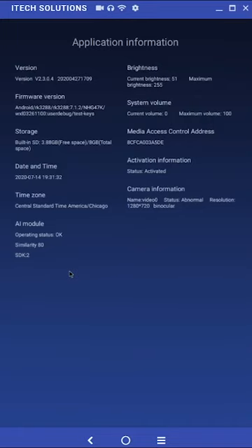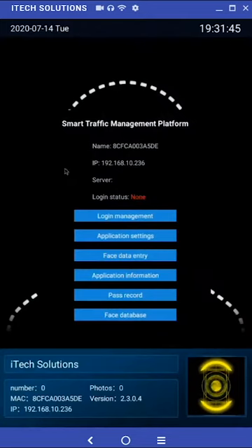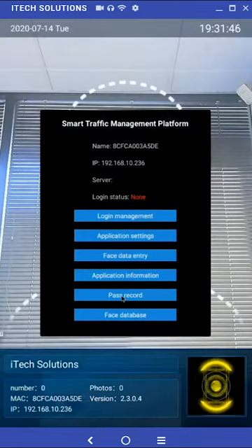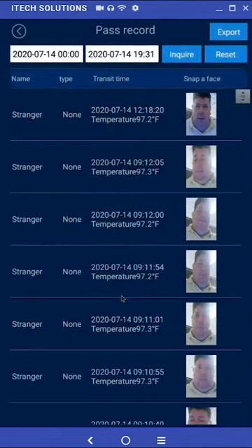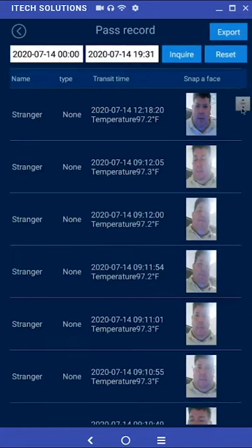Pass record. This is where you can view the check-in history of the kiosk. You will be able to see the registered users that have checked in as well as the time and their temperature upon check-in.